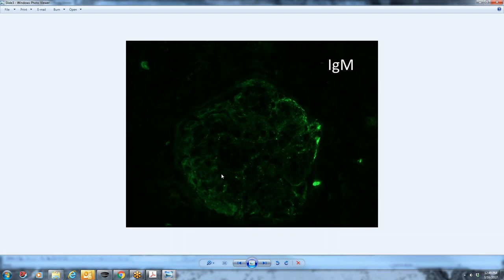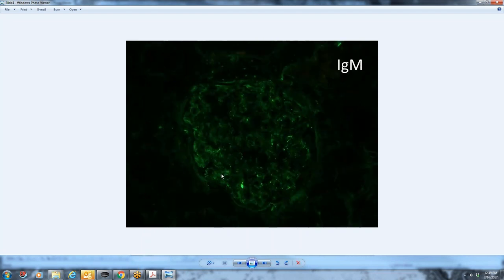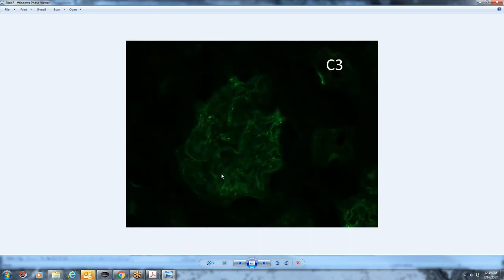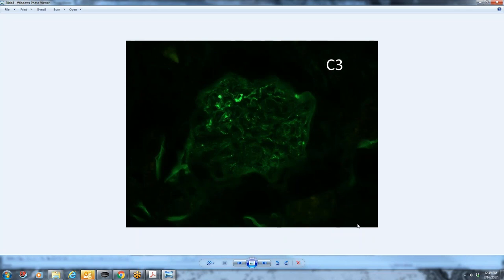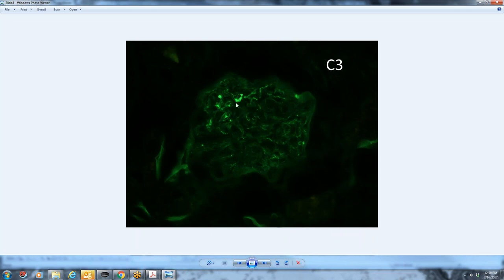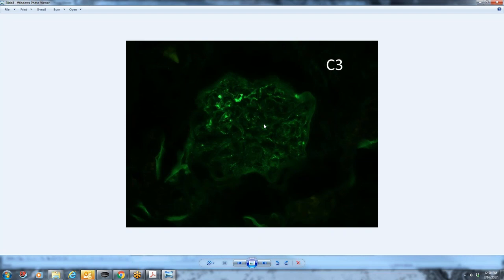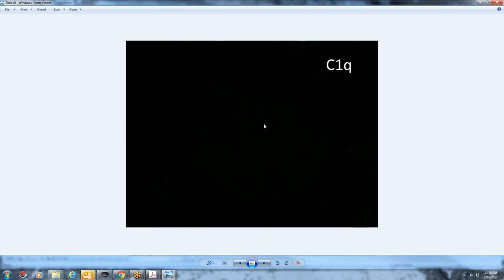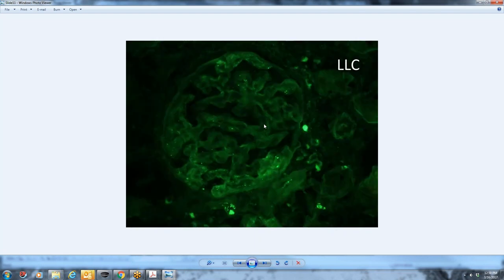This right here, these are actually podocytes that have droplets inside their cytoplasm. So the IgG is only in podocytes. So the IgG was relatively unimpressive. IgM is always there. IgM is just a very sticky molecule. It does have a little bit of granularity, but it's not, it's always pretty much this degree or even stronger. So I'm not trustworthy of the IgM. The IgA is completely negative. The C3 is here. And I think that this is what's kind of cool about this case is we do have these dots and it is pretty granular. You can even see another glomerulus coming up here that has dots as well.